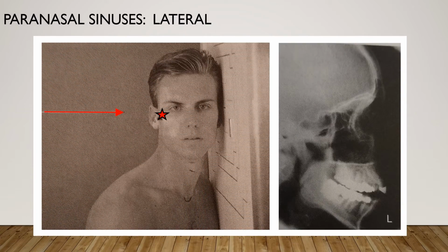For the lateral of the sinuses, you're just going to take one. Typically, we take the left, and the reason that we take the left is because the patient is going to be facing us, and we can actually move the image receptor up and down much easier than having the patient turn the other way. The patient's going to be facing the IR. They're going to turn the head into a true lateral.